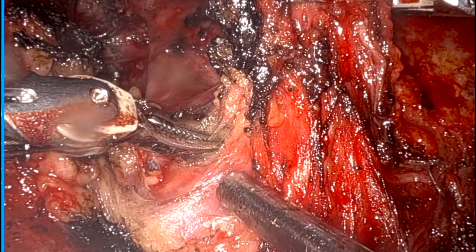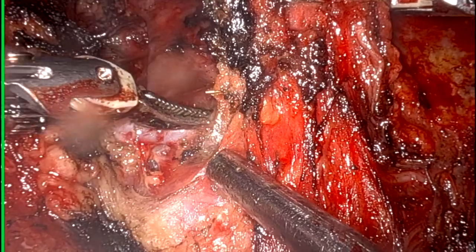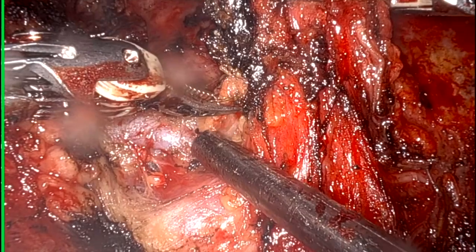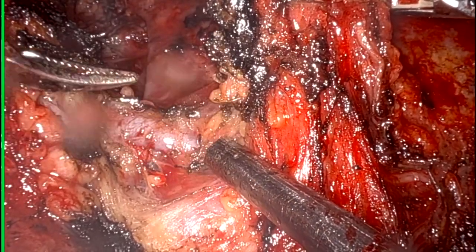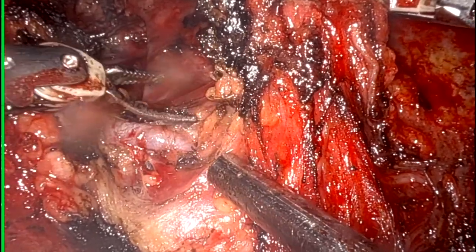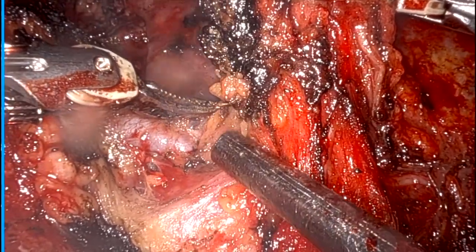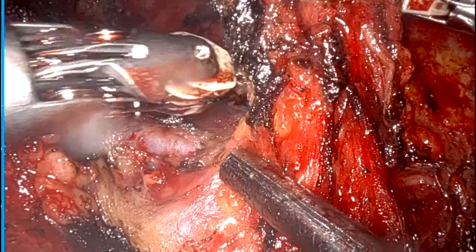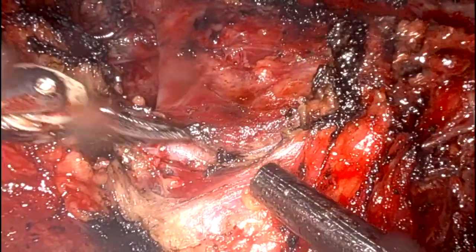Guys, we have three approaches to do level 2 and 3. One, lateral to medial, in which we start from the sternocleidomastoid muscle and take our specimen out at the superior thyroid artery. So this is lateral to medial. The other one is medial to lateral, where we start medially from the superior thyroid artery and end up at the sternocleidomastoid muscle. And the third one is a mixed approach. And I use the mixed approach. I start from the lateral end, stop in between, and then come back from medial to lateral. Same mixed approach you will see today.